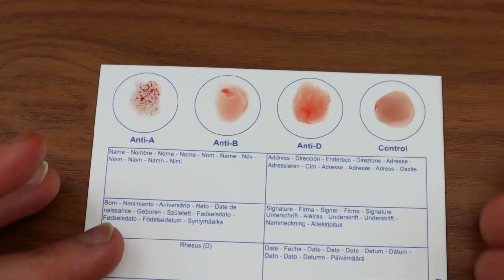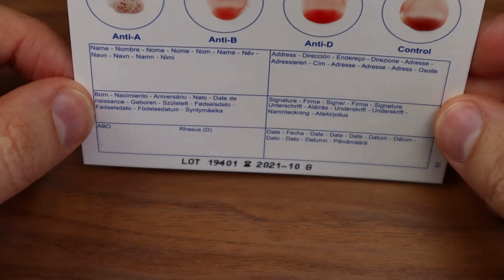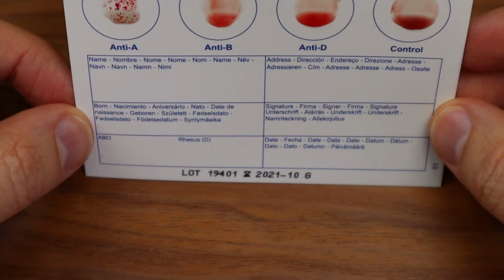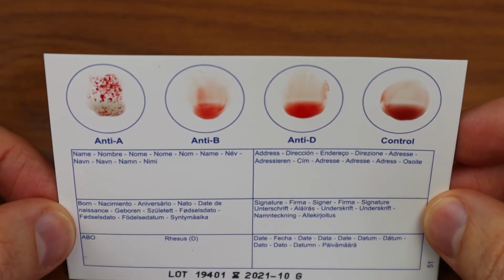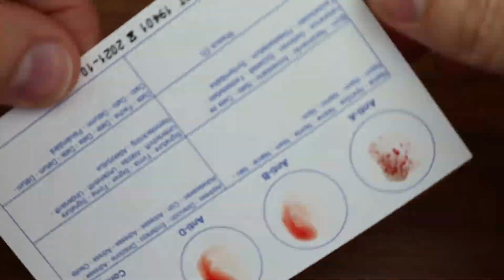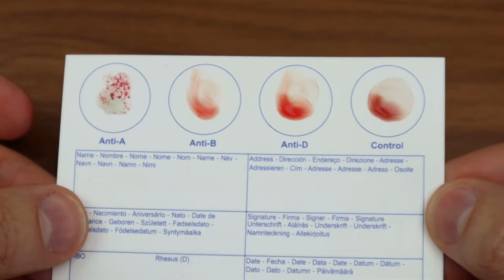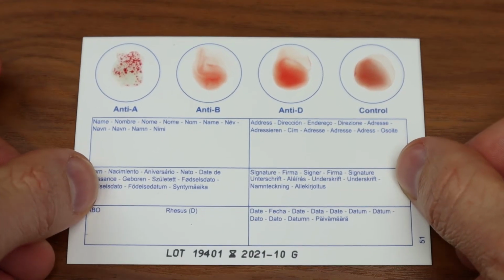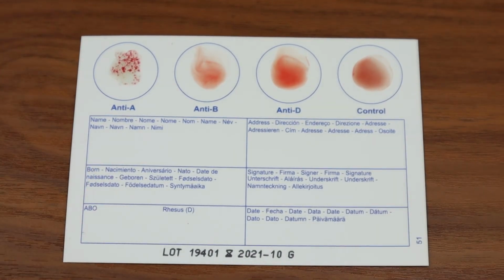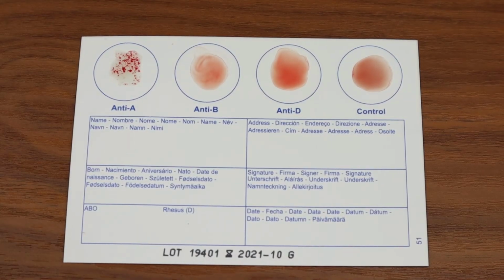Next, tilt the card and hold for 10 seconds at each angle so that everything mixes well. After 40 seconds of tilting the card, lay it down and you should see some clotting in one or more of the circles. In this example, the first circle clotted, and if you refer to the diagram on the instruction manual that came with the kit, you can see that my blood is A negative.